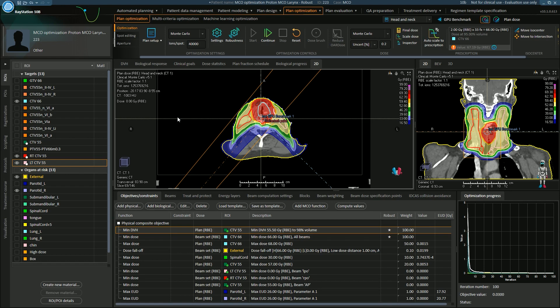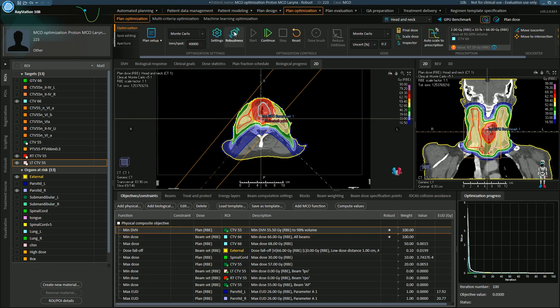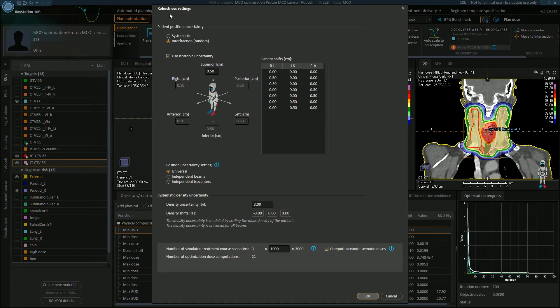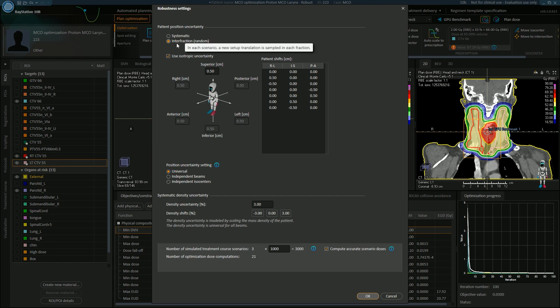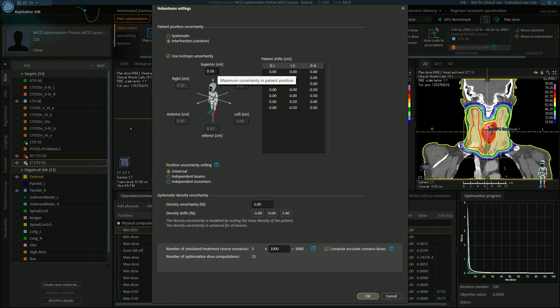What is the uncertainty and how do we define it? Up here, we select robustness and we can see the robustness settings. The first uncertainty is the patient position uncertainty. In RayStation, you can have a systematic uncertainty or an interfraction uncertainty — a random error. In this case, we are assuming that every single day our patient will be set up slightly differently, so every day there is a different error. We define that error and I've asked for 0.5 centimeters in all directions. And here I can see all of the different scenarios that could occur.